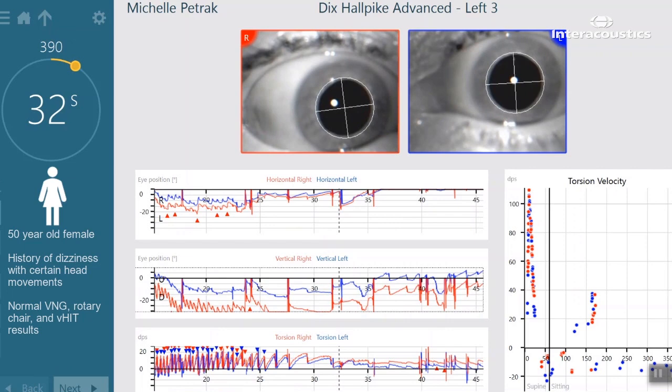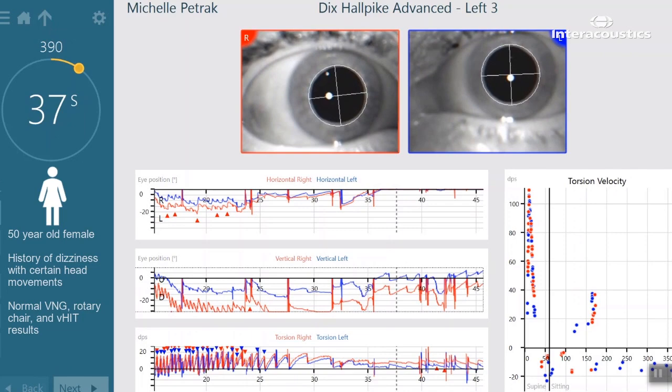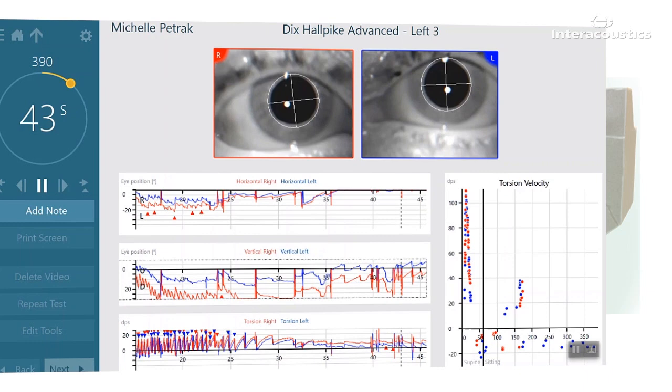Sometimes the torsional nystagmus is so small that it's difficult to rely on the video. The torsional algorithm can measure nystagmus as small as one degree, providing clinicians with the precision they need.